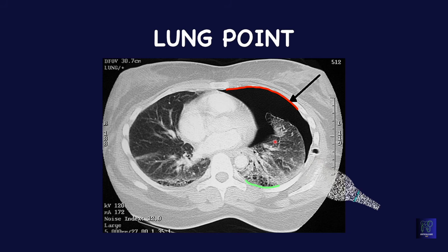If you examine carefully, you're going to reach a point where there is going to be lung sliding on one side of the screen, and there will not be any lung sliding on the other side where the lung is separated from the chest wall. That basically is lung point.